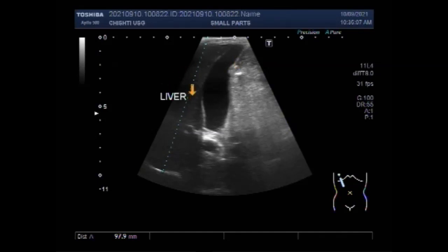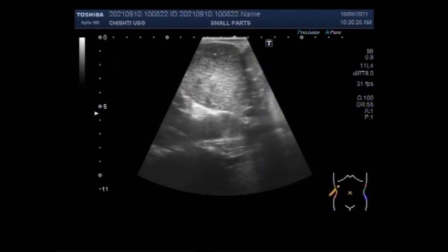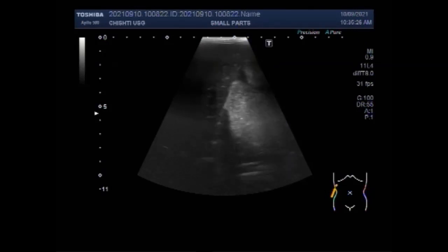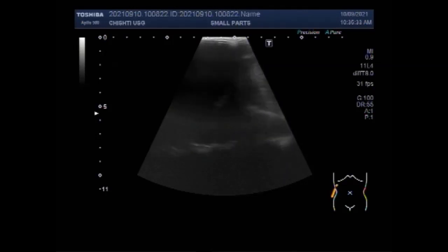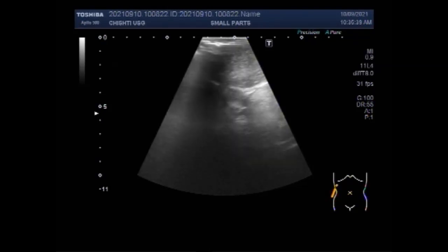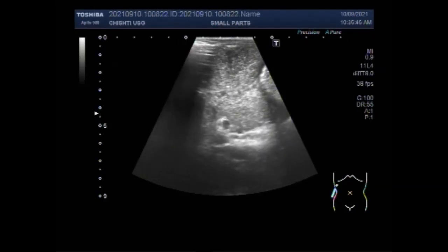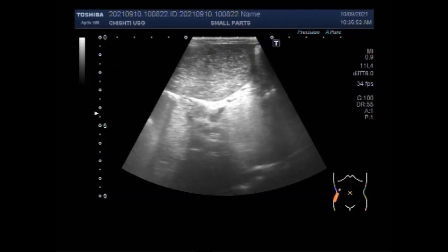Dilated small bowel loops measuring more than 2.5 centimeters from outer wall to outer wall, with normal caliber or collapsed loops distally, are signs of intestinal obstruction. As you can see in this case, the dilated gut loops measure from outer wall to outer wall more than 3 centimeters — more than 30 millimeters.